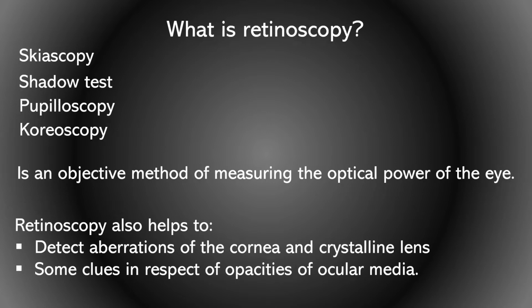And as retinoscopy doesn't need the patient's response, it is a very helpful tool with uncooperative and malingering patients, infants, deaf patients, and in all such cases where language or communication creates difficulties during the process of refraction.